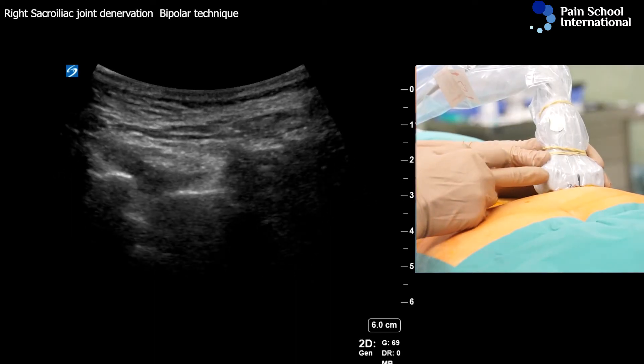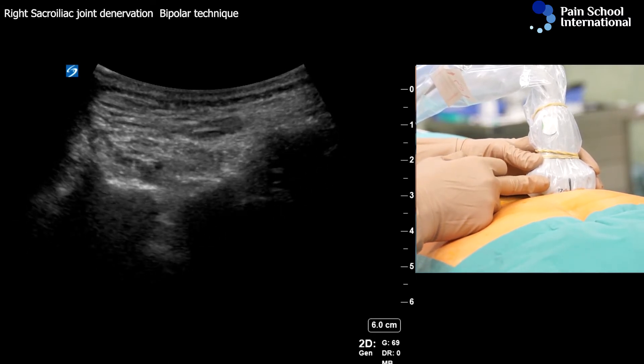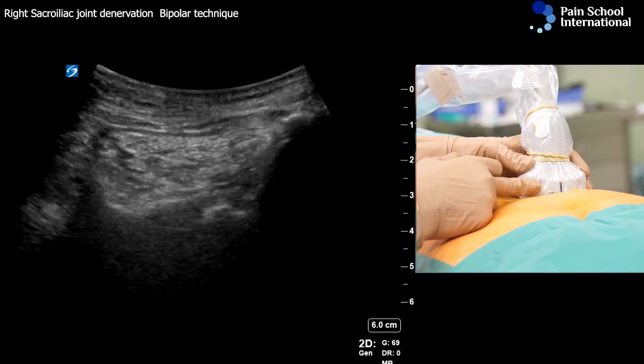This is S3, and then sliding cephalad, this is S2, and then sliding cephalad again, this is S1.